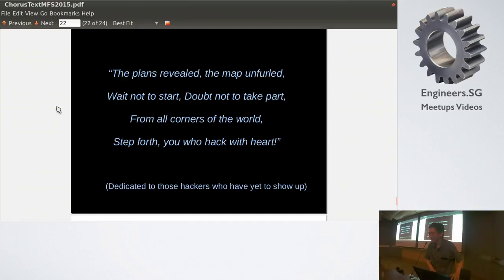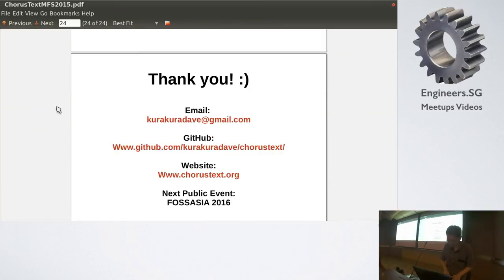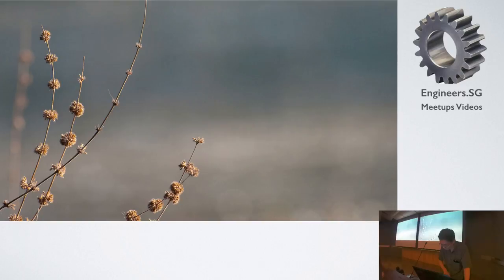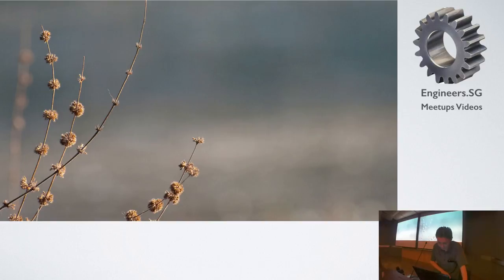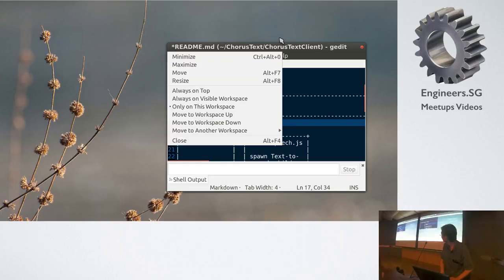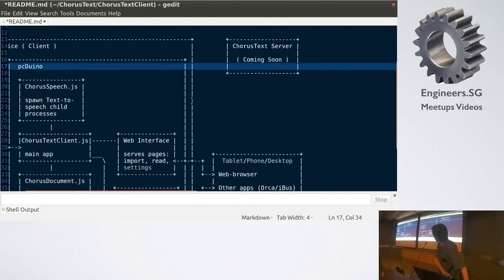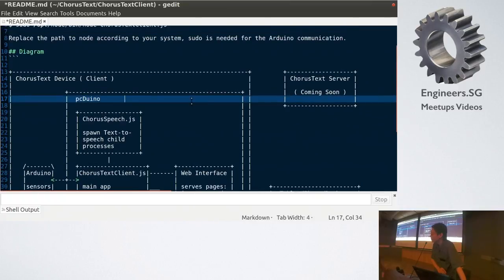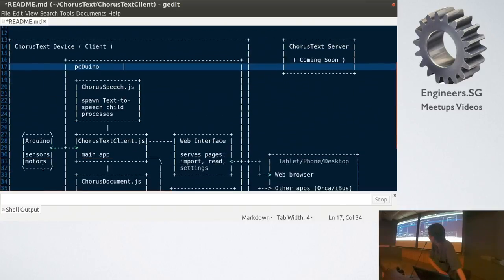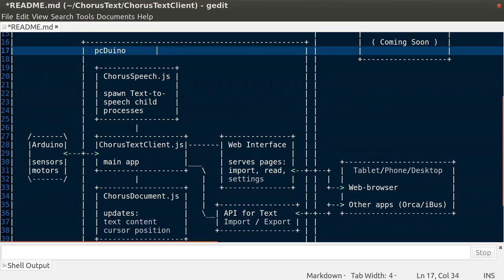So, okay, so, let's look at the Node.js part. Hang on. Yeah, so the, on the left is the device. And, in the device, I have the Arduino on the lower left. It's doing, it's hooked up to sensors and motors. And, it's communicating with the main app, ChorusText Client.js, through node serial port.